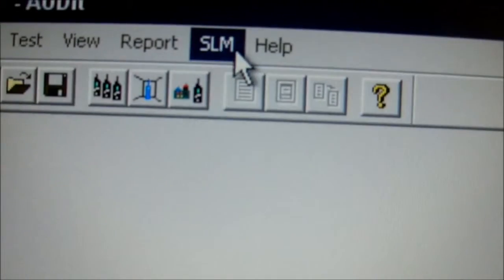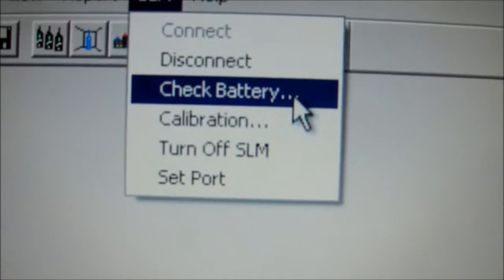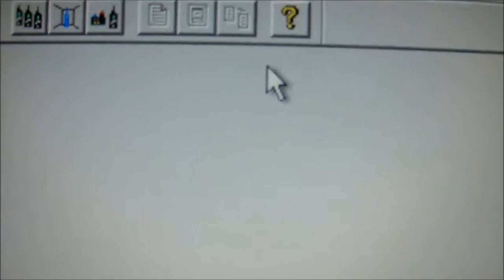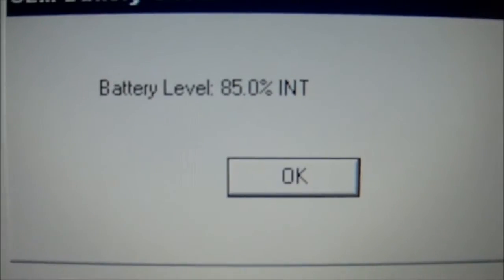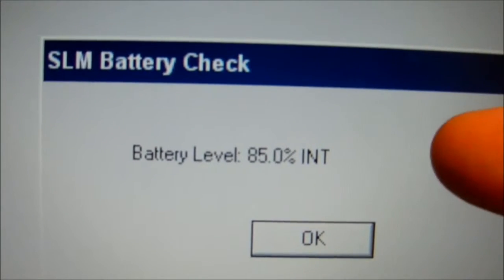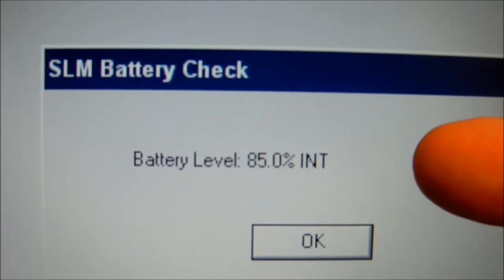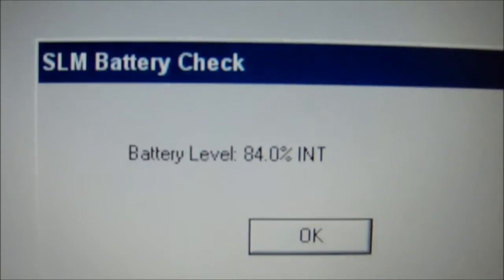And we go back up to SLM. Here we can check the battery and we can check the calibration. Let's do a battery check. Right now our battery is at 85%. It's on battery power. If we plugged it in to the AC unit it would say AC. Let me hit OK.